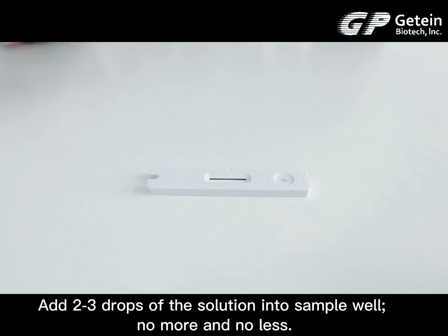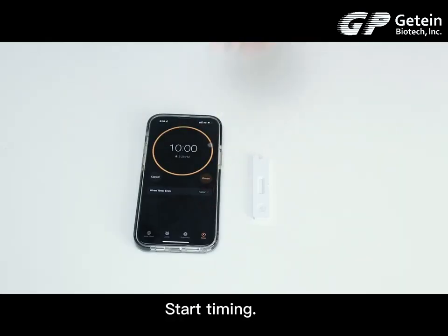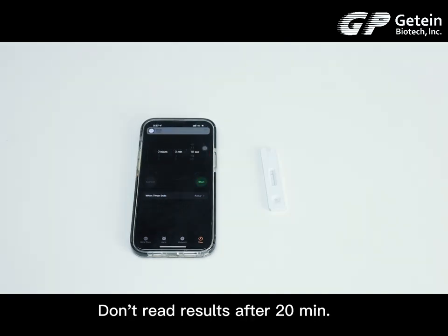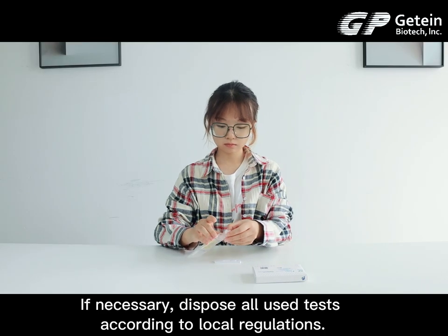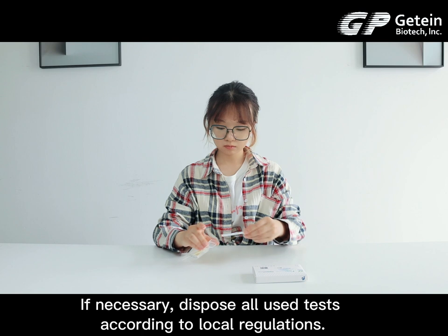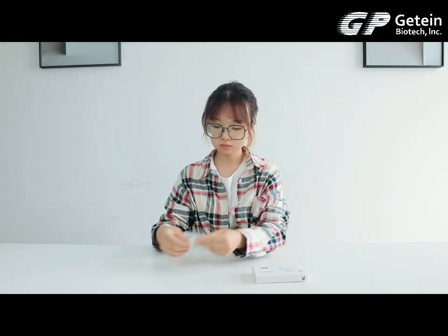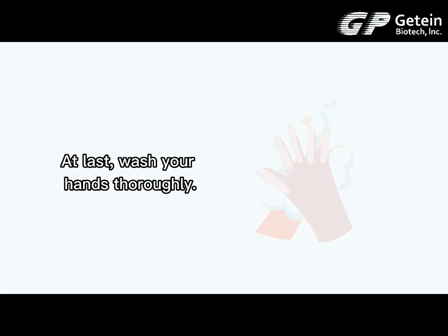No more, no less. Start timing. Read the result visually in 10 to 15 minutes. Do not read the results after 20 minutes. If necessary, dispose of all used tests according to local regulations. At last, wash your hands thoroughly.